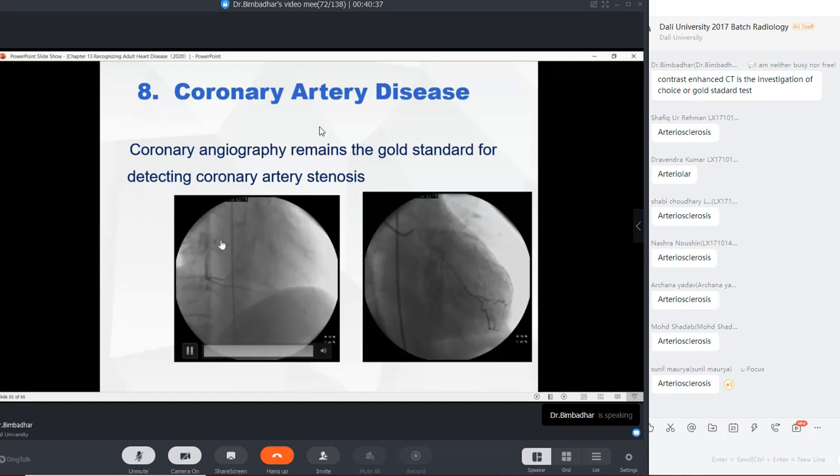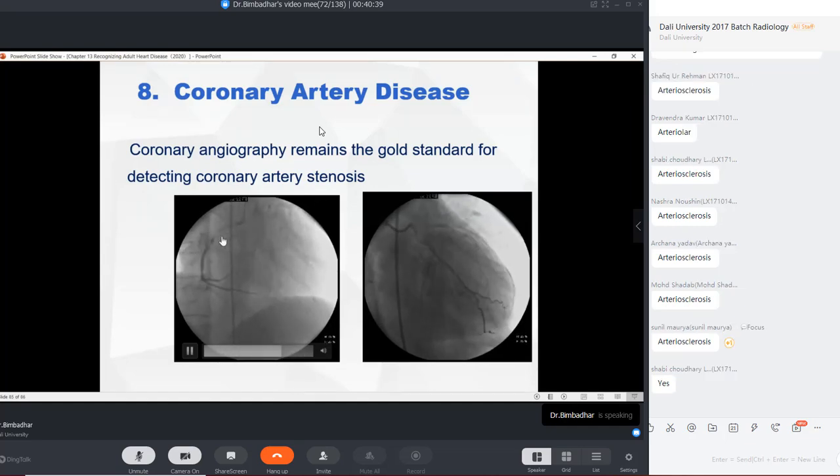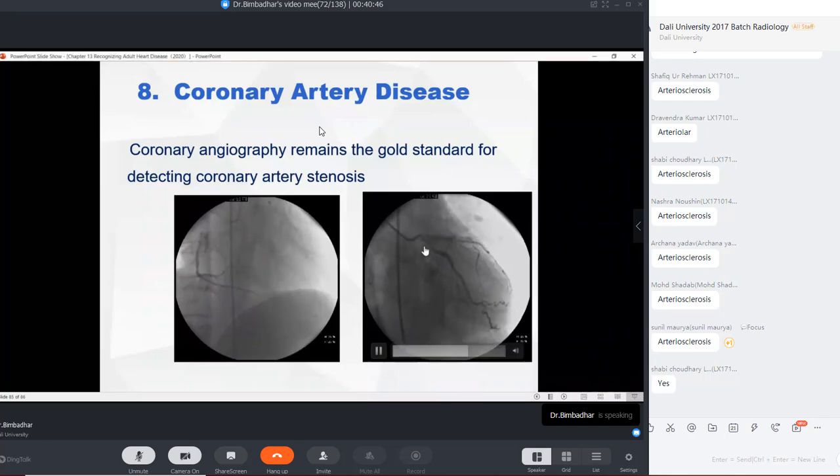And you see here, the lumen is quite narrow here. There is no filling up of blood, right? When you look closely in the animation, that's the place where this lumen is not completely being filled up, which means to say it became narrow there. So that is how, that is actually the descending artery.